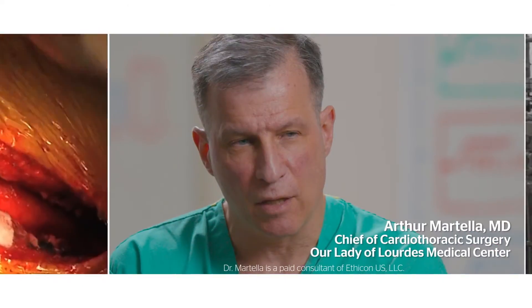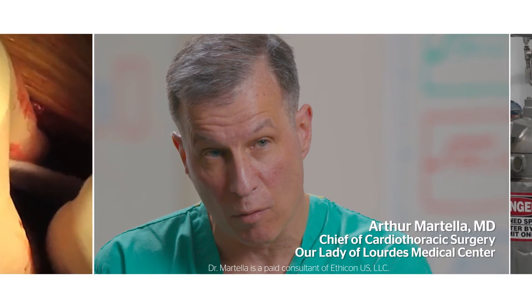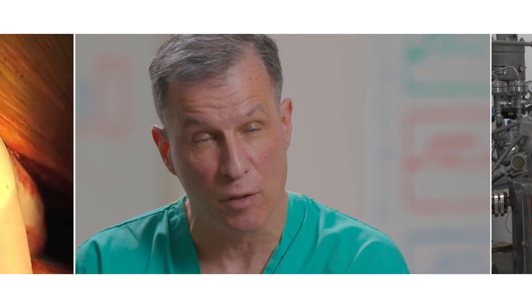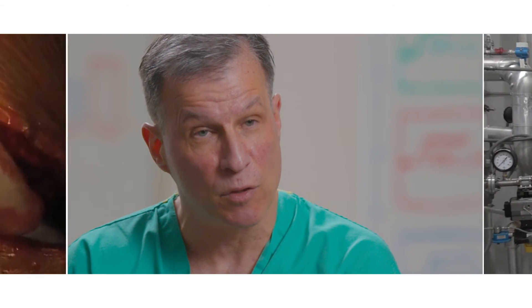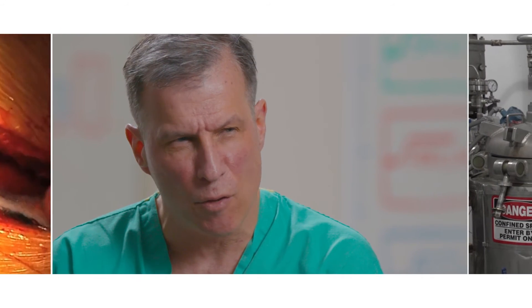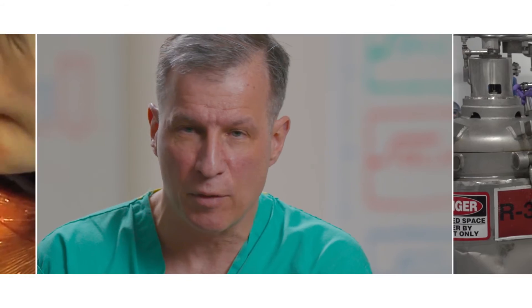I would say that the Surgicel Fibrillar and Surgicel Snow are my go-to products in most patients who have any indication that they have a continuous oozing bleeding type scenario. In those situations where it's not amenable to any of the standard techniques, I will quickly move to these products.